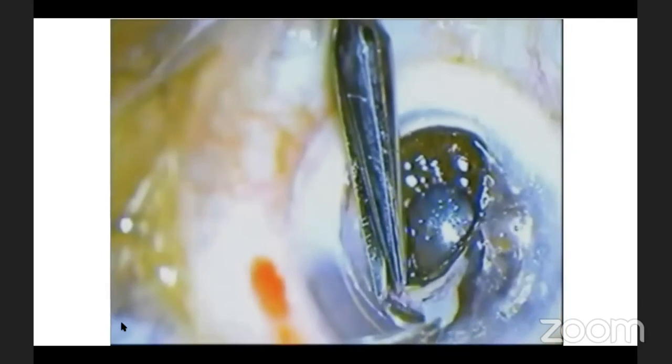Now in this situation, we have a perforation below the stroma while we were dissecting. So there we are putting air into the anterior chamber, giving a layer of fibrin glue on top of it. Fibrin glue adds bulk and this helps us to carry on the dissection further, and we can really go up to the clearing of the Descemet or as big as possible in a better way.